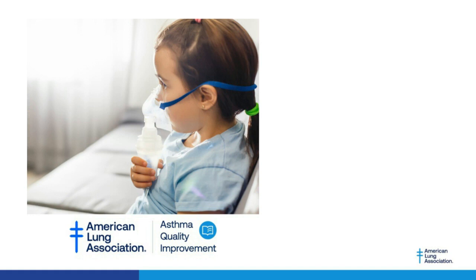What you want to make sure you do is wait an appropriate amount of time for the room to air out before anybody goes into that room without full PPE, right? You wouldn't want to room the next patient. If you don't know the air exchanges, you'll have to wait 2 hours. If you can hire the air balancer people to come in and measure the air exchanges, then you can use a shorter wait time. But it's safe. You can go ahead and do the spirometry as long as you have a significant amount of wait time between patients.